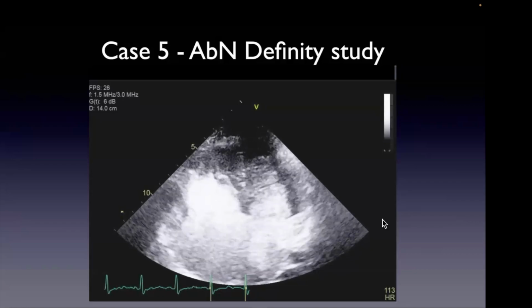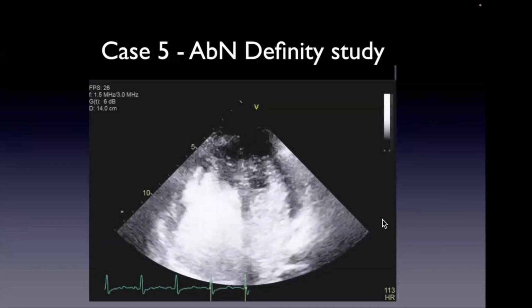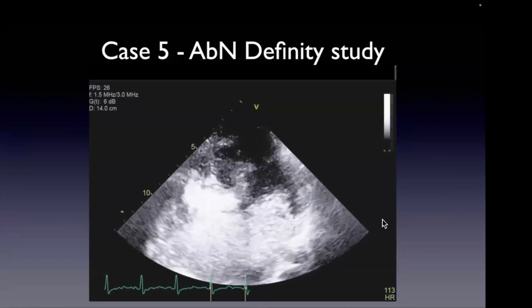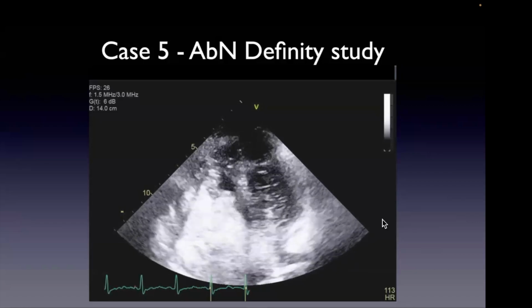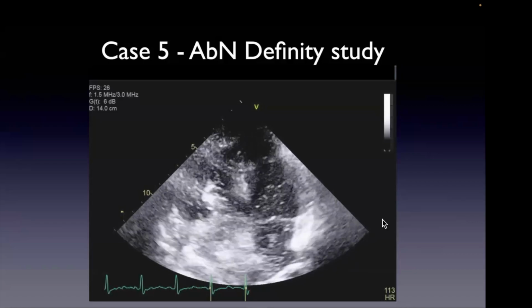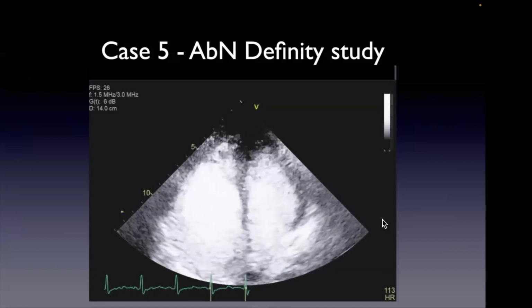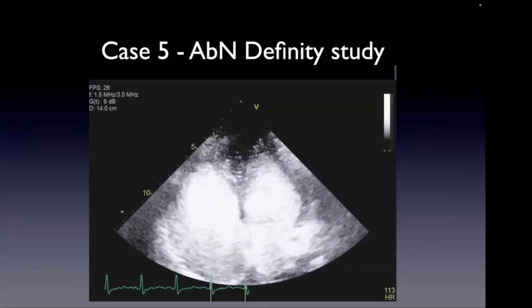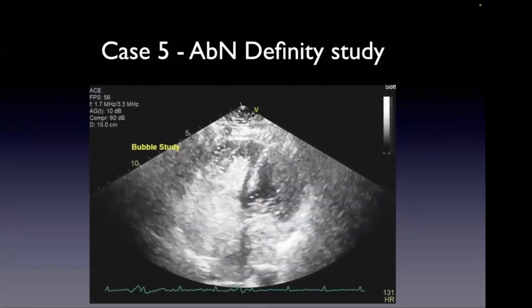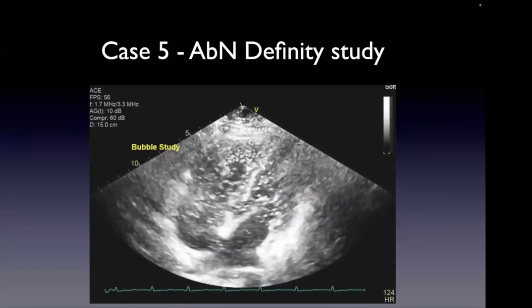Yeah. And actually, the flip side is that a large shunt with severe pulmonary hypertension, like an Eisenmenger ASD, for example, is probably a relative contraindication even for saline contrast, because you can still have symptoms with saline contrast injections in these patients. All right, so this is not DEFINITY. This is a regular good old saline contrast with microbubbles.